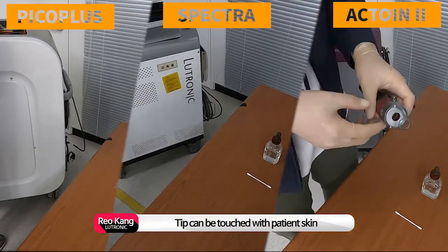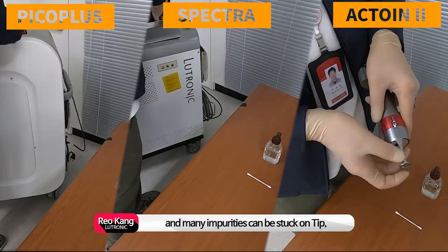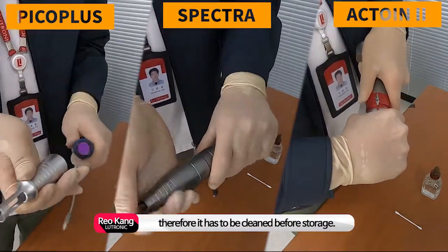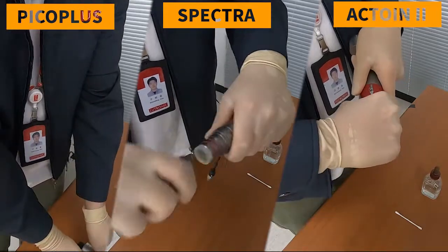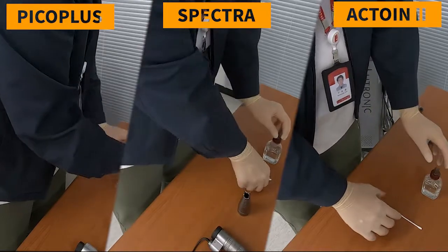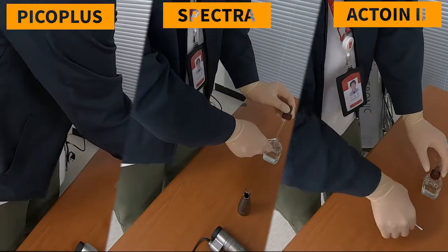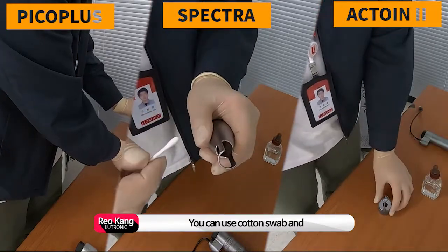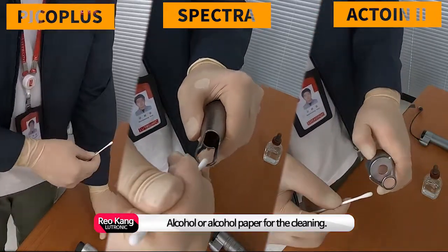The tip can be touched with patient skin and many impurities can become stuck on the tip. Therefore, it has to be cleaned before storage. You can use a cotton swab and alcohol, or alcohol paper for the cleaning.